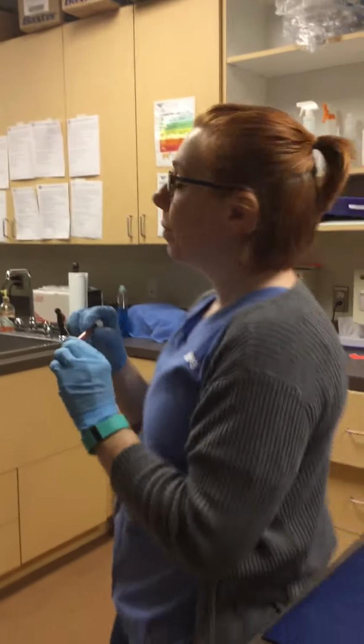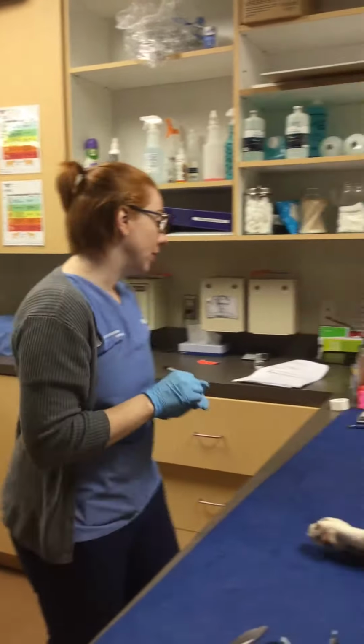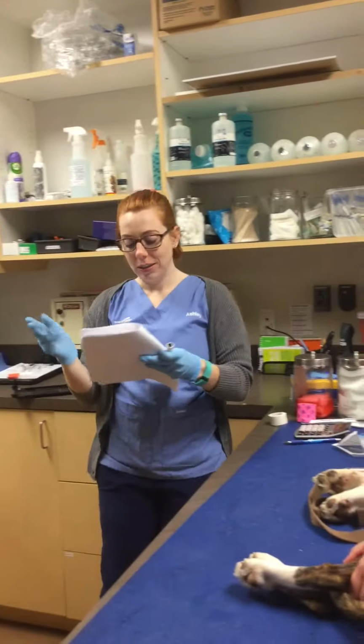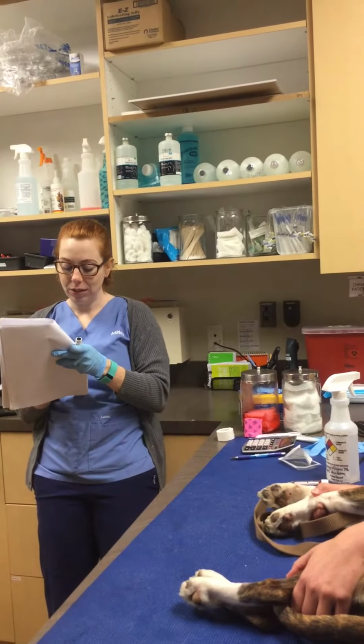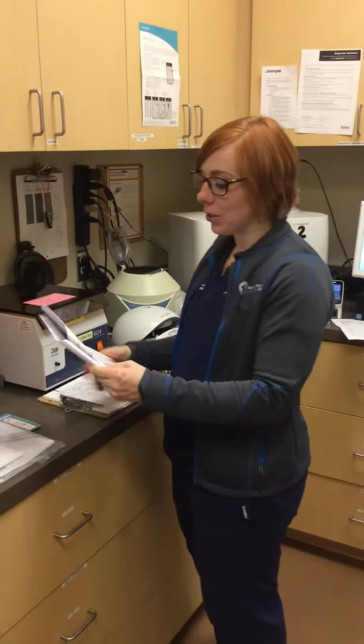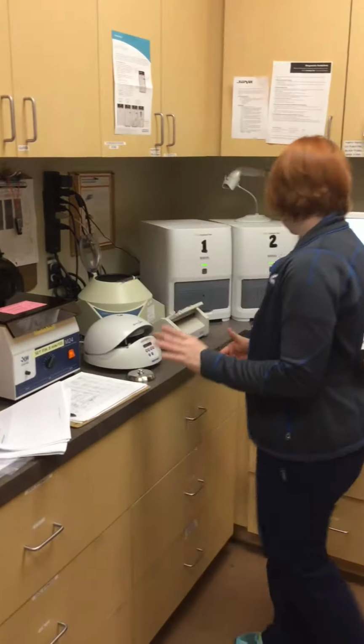So once the clot forms, then I'm going to record it in the chart. So the chart's here, and I'm going to record the time of 3 minutes and 10 seconds. And that's it. This is Ashley Anderson, and this is task 11, doing a snap test on Eliza.